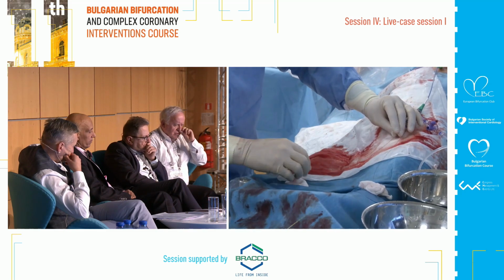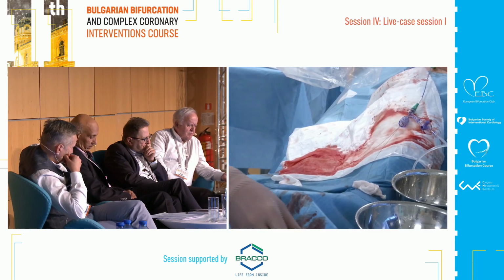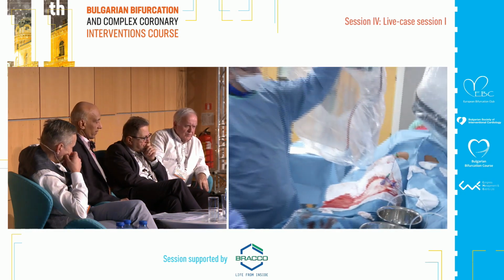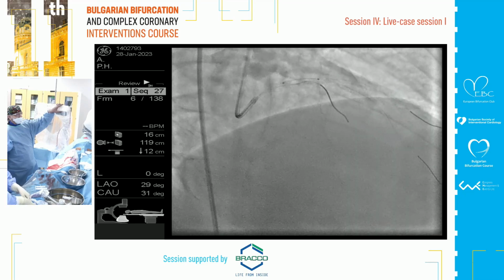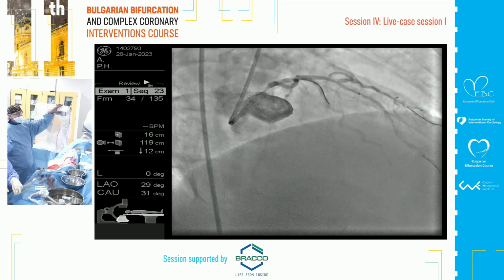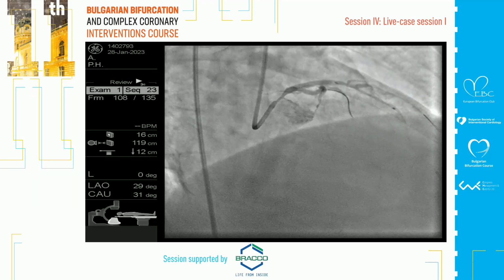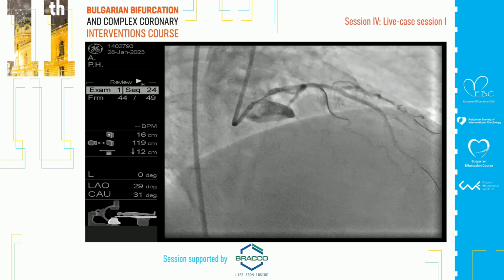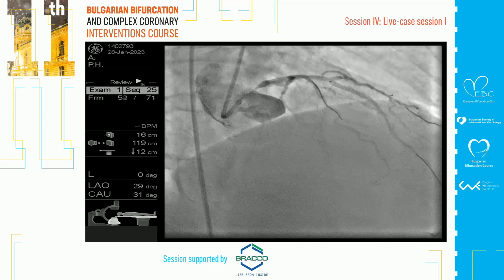Okay. Can you show what Valerie did during the procedure? I will show you all the stuff. This is the stent in the distal lesion, the bifurcation of the big diagonal. This is the stent after the expansion. So we did some POT.